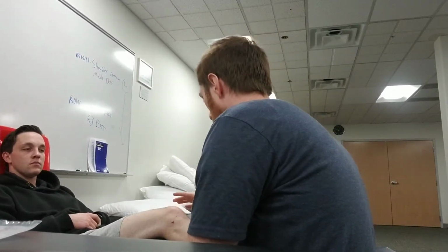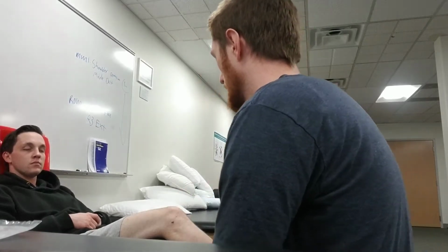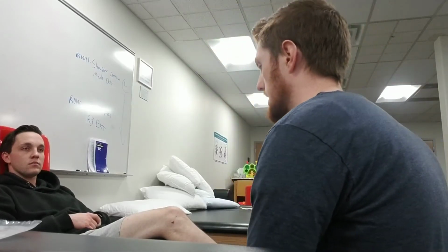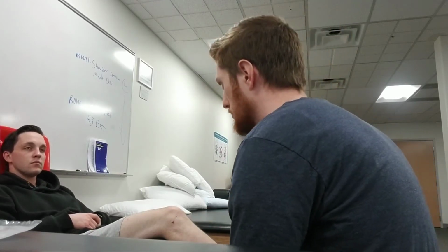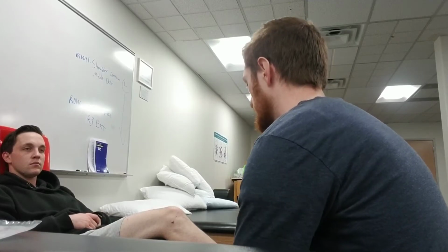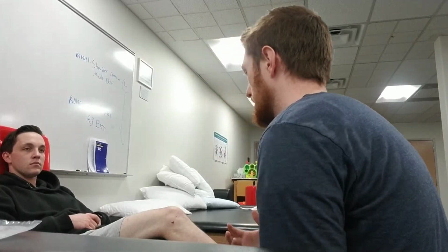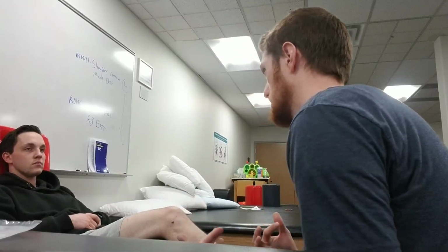So what we're going to do is I'm going to use this e-stim machine, and I'm going to put it above and below your knee. And so it's going to focus the area in between the pads where I place them. When I put it on, you'll just feel like a tingling sensation. I'll increase the amplitude, I'll increase the power of the e-stim just so that it's comfortable, but it should not be painful. It should just be like a comfortable tingling sensation. And basically when we put this on, the sensation that it gives you overrides the pain receptors that are going from your knee to your brain. So instead of getting pain, it's getting the tingling sensation and reduces the pain you're feeling.